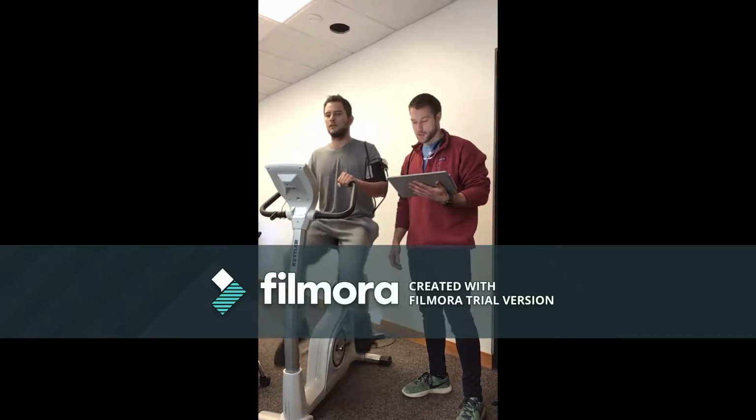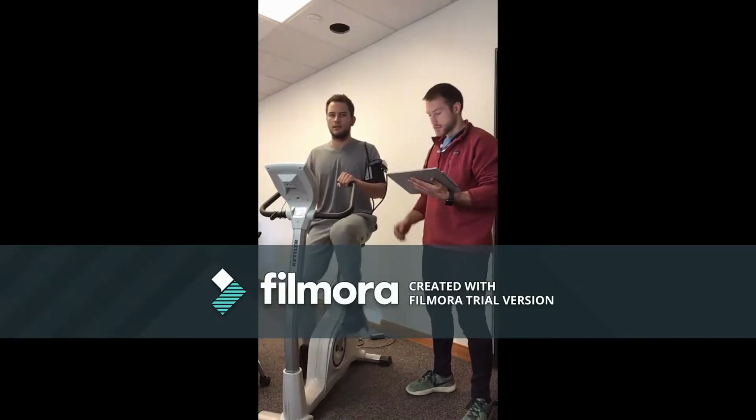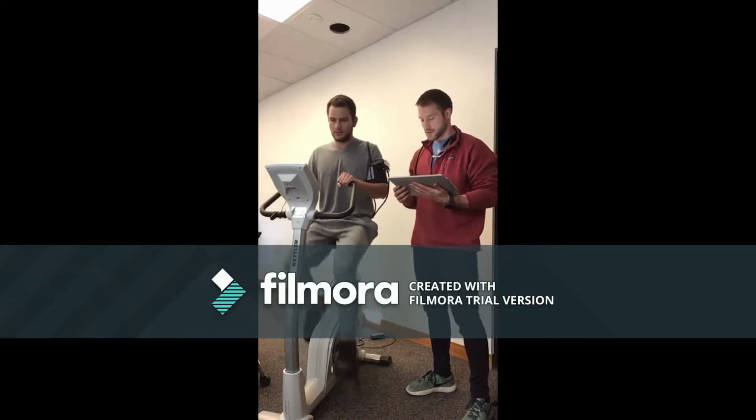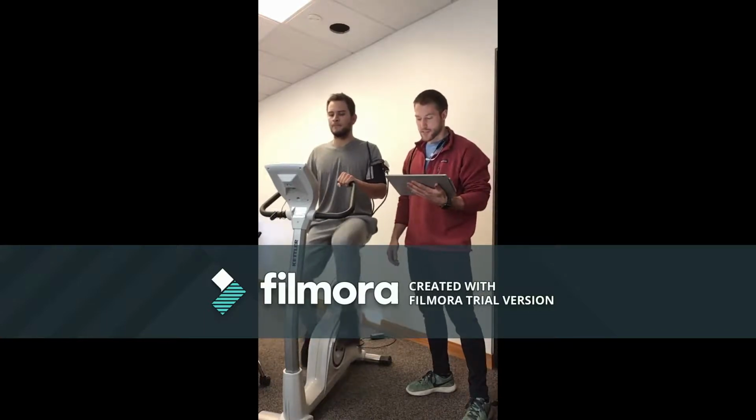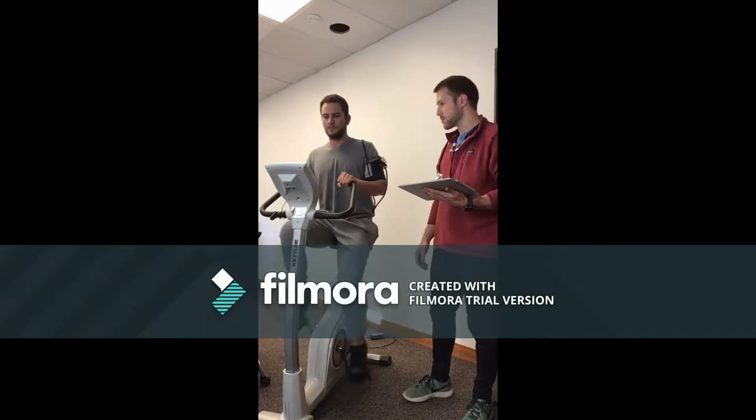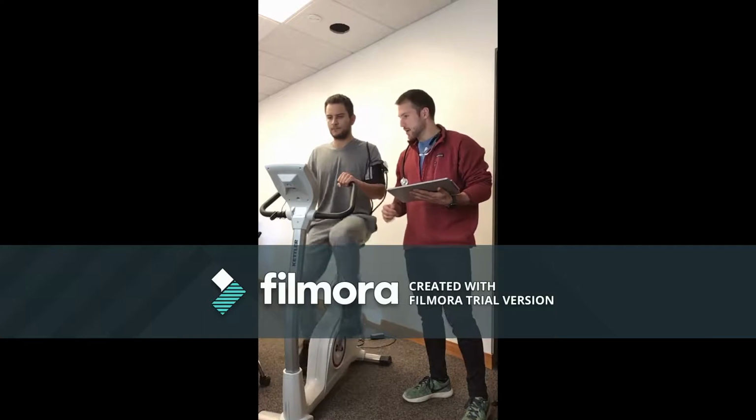We just took your vital signs as well, and they were also looking great. You had a systolic blood pressure of 124, a diastolic of 78, and your heart rate was at 80. So we're ready to ramp things up a little bit here and get you going to start the test.